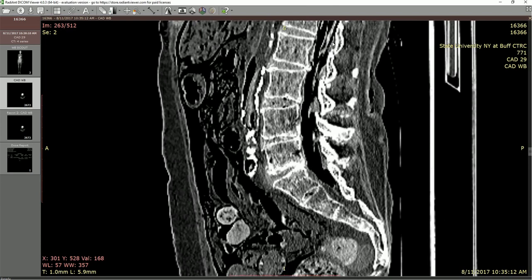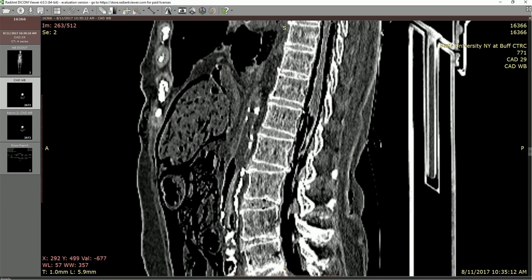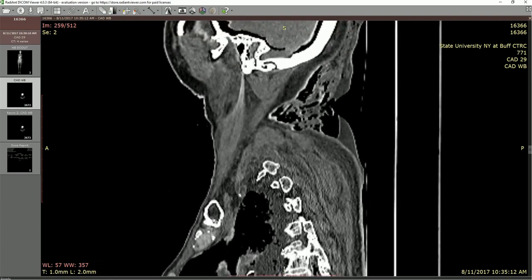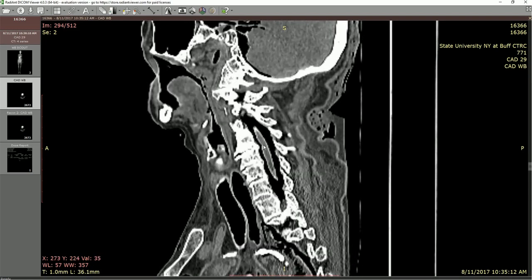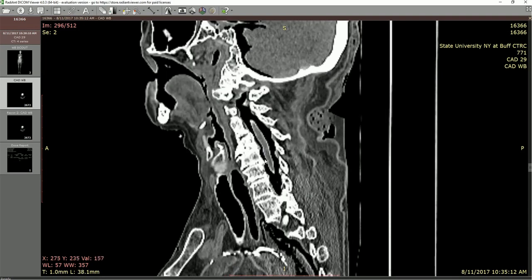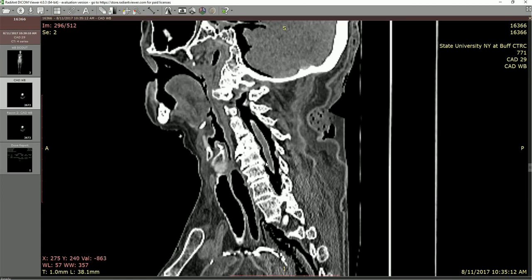Zooming in on the vertebrae for a quick second: this was an older individual and we already saw pathology. You can see some darkened areas and almost vertical streaking within the vertebrae. In an earlier recording on the vertebral column, I noted that streaking is a sign of osteoporosis. You can see an intervertebral disc here nicely — a little bit of the nucleus pulposus in the middle. Some areas show posterior contact, so not the healthiest situation. Particularly when we get into the cervical region, you can see fair bit of pathology — it looks like a couple of spots of compression pushing in on the vertebral canal, possibly osteophytes or bone spurs impeding on the vertebral canal.